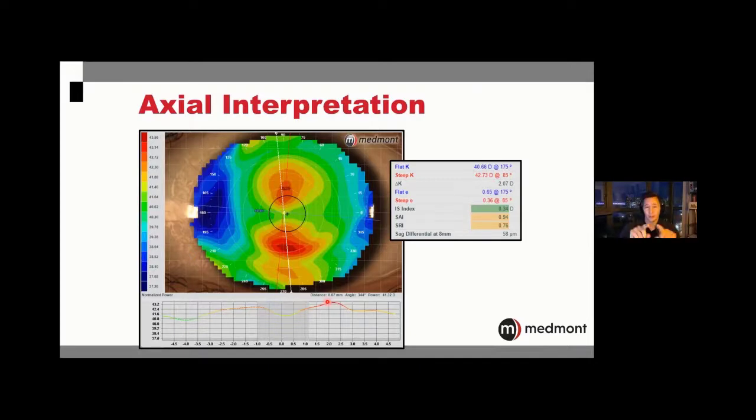Of course, that's the rate of corneal flattening of the eye. It gives you an idea of the height of the eye. And here we see the cornea has an absolutely normal 0.65 eccentricity. The disease detection indices are green for the first, yellow for the next 2, saying that 2 of the indices are saying the eye is suspect. It's yellow in the disease detection analysis.